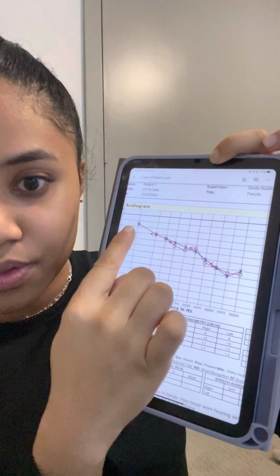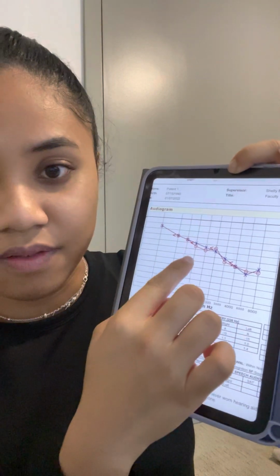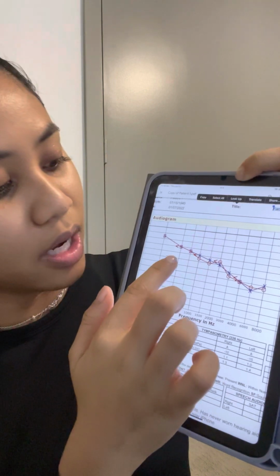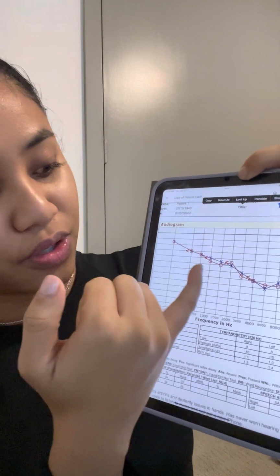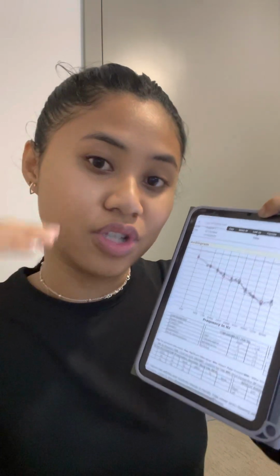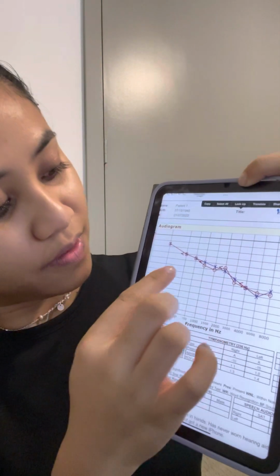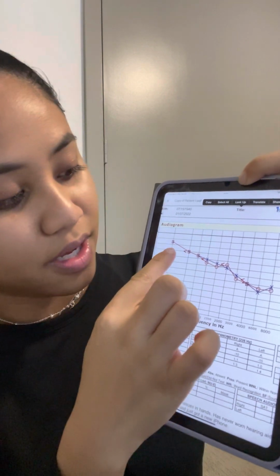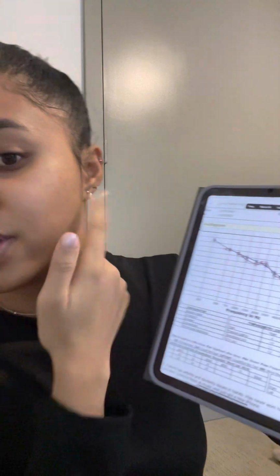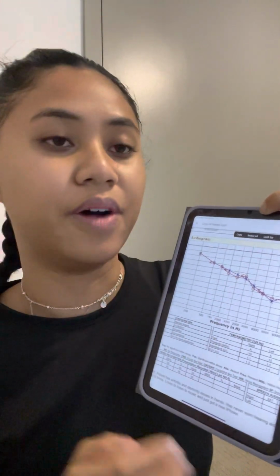So all the red is a representation of your right ear. The red circles tell me when you heard the sound the softest, the quietest. And then also we've got your blue X's. Your blue X's tell me where your left ear heard the quietest and softest sound.